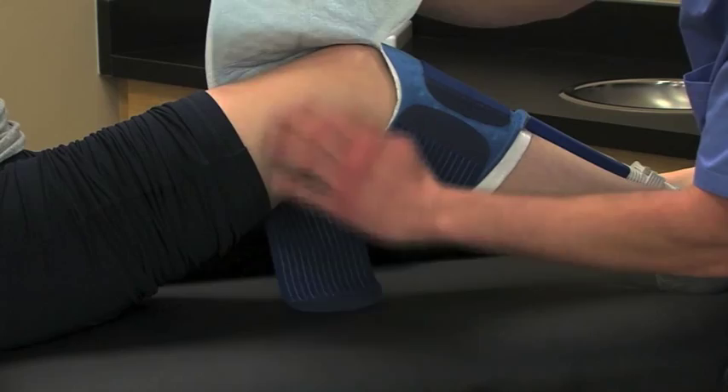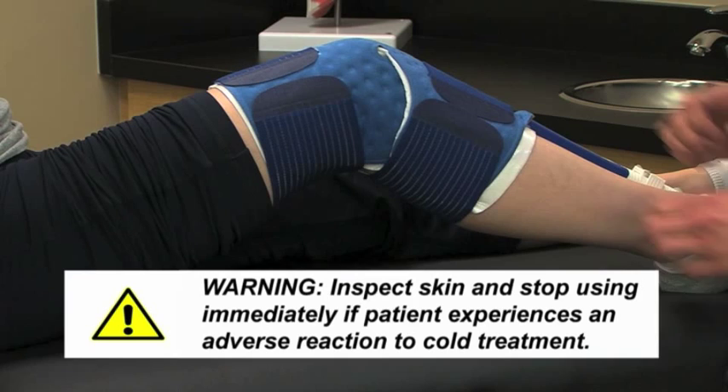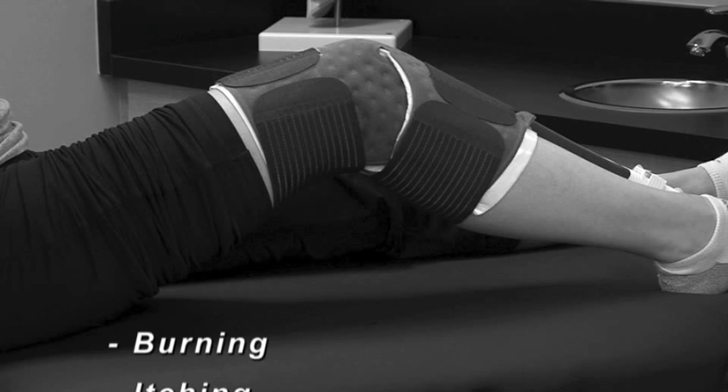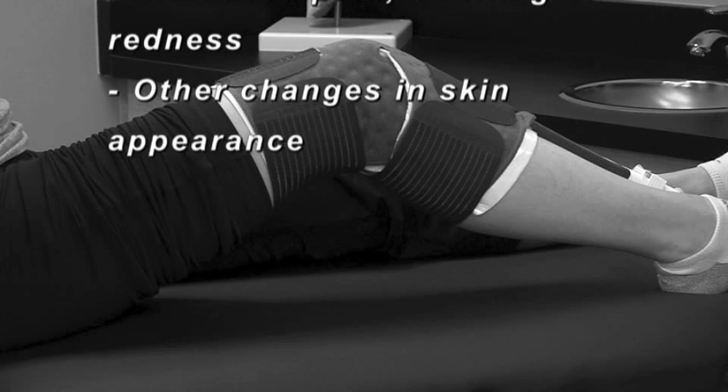You should be able to inspect the skin by lifting the pad and insulation barrier. Discontinue use and contact the physician if your patient experiences any adverse reactions, such as burning, itching, blisters, discoloration, welts, increased pain, swelling or redness, other changes in skin appearance, or any other reactions that have been discussed with the physician.